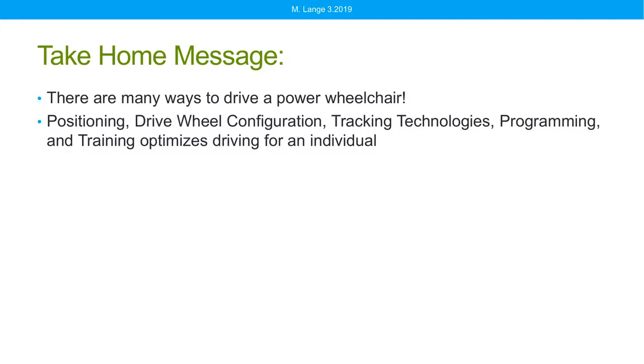So don't worry, we're not finishing yet, but here's our take-home message. There are a lot of ways to drive a power chair. Hopefully this webinar has shown some of that, as well as the resources that you have. Positioning, drive wheel configuration, tracking, programming, training, all of these are very, very critical in optimizing driving for an individual.